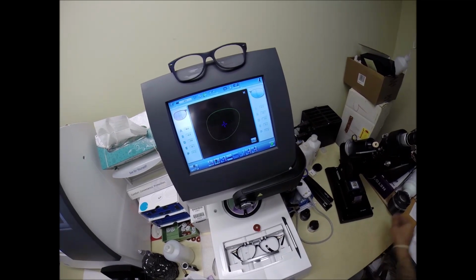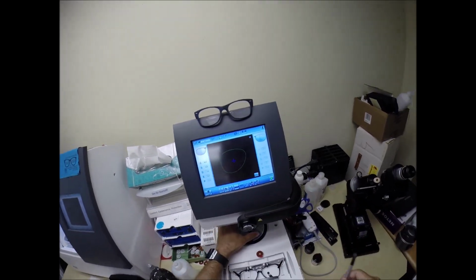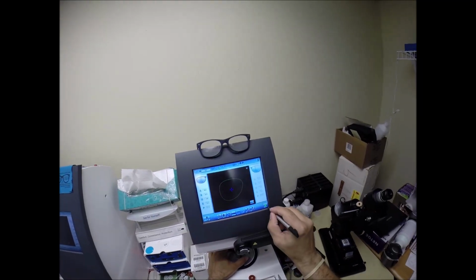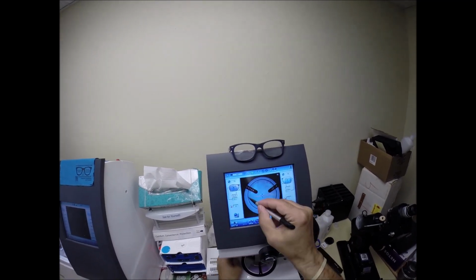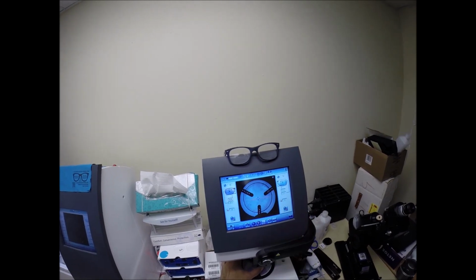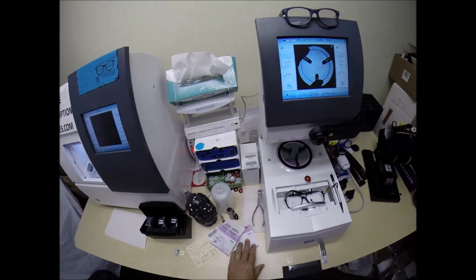Okay, that is the shape that we'll be cutting. Excuse me, I had to change out the battery there, but that is the shape that we'll be cutting. Normally with the dots on the lenses, I would orient it in there just perfectly. I don't need to this time. I'm going to move it onto the next screen. And all I have to simply do is make sure the lens is centered inside the one I will be cutting. Hit that button, the arm comes down and places the block onto, which will essentially be the right lens.